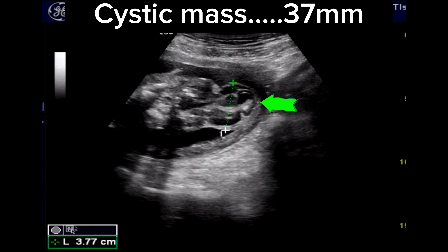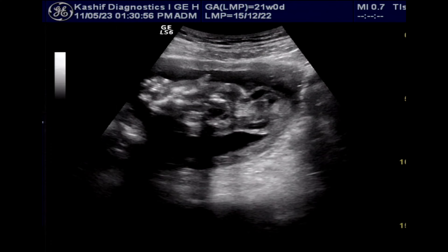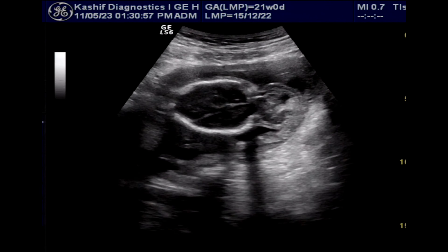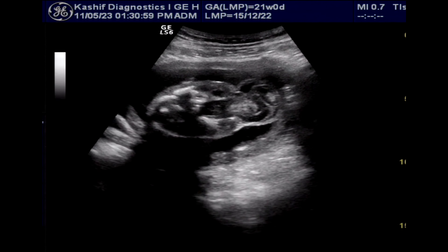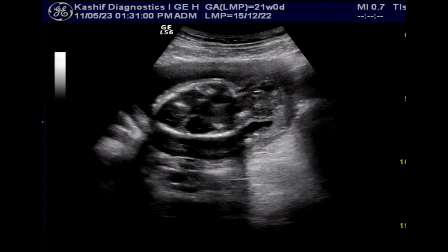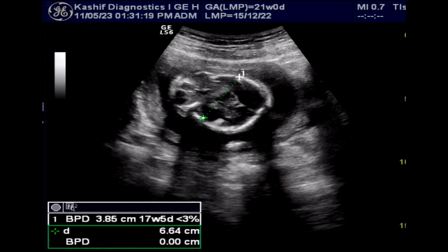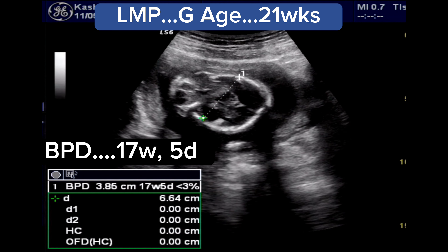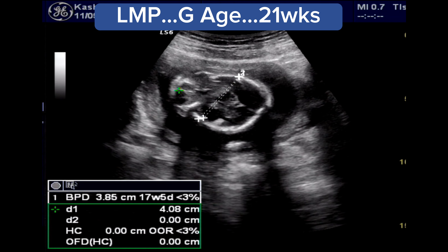Encephalocele happens when the neural tube does not close completely during pregnancy. The result is an opening in the skull. The most common site is at the back of the head. The fetal head is also small according to BPD.